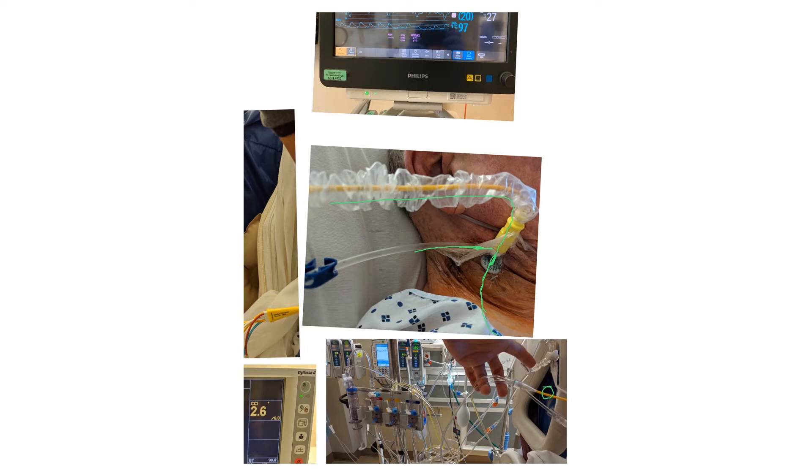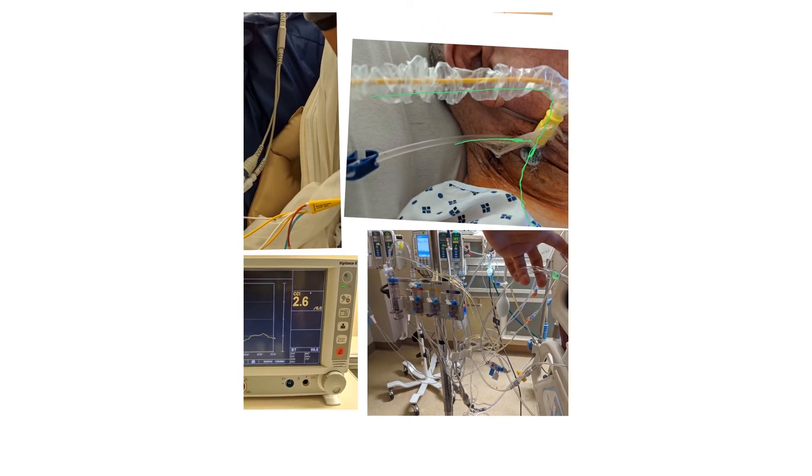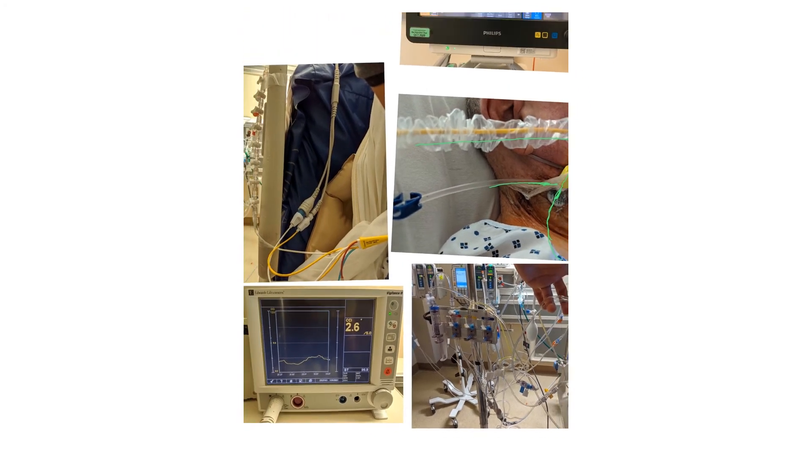The yellow tip is here, and there are multiple ports: one to measure CVP, one for wedging and measuring pulmonary artery pressure, and one to be connected to cables to measure cardiac output. This is typical for somebody on a Swan — you see all these wires, pumps, and medications, because usually these patients are on multiple infusions at the same time.